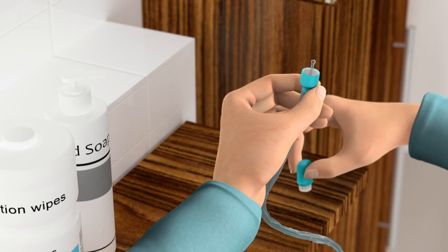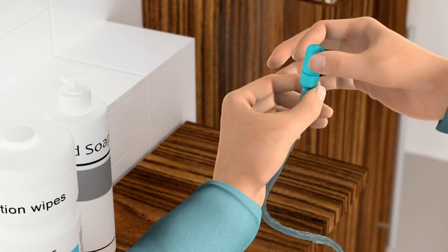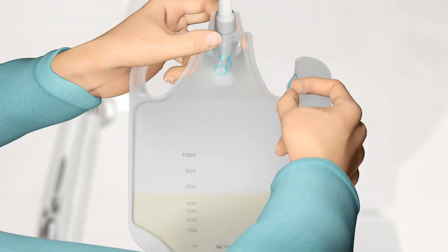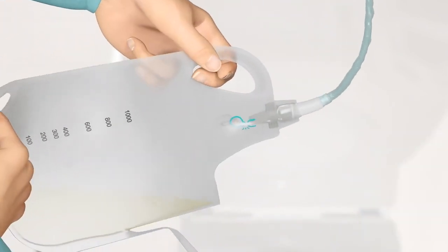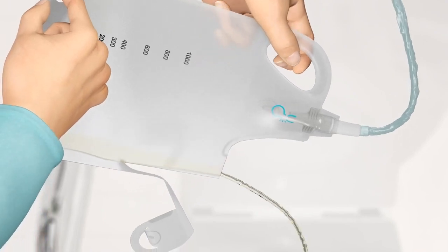After use, the product can be reclosed with a turquoise cap. To prepare the bag for emptying, pull horizontally on the pull tab. The bag foil will automatically split along the indicated line. Grab the top and bottom handles for support and carefully empty the bag into the toilet.